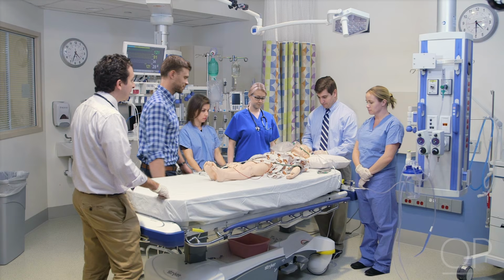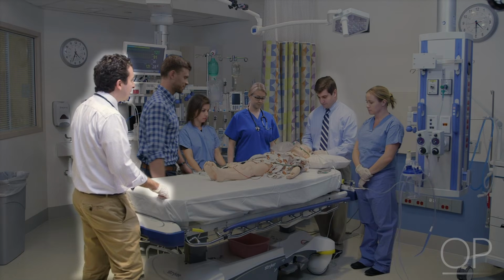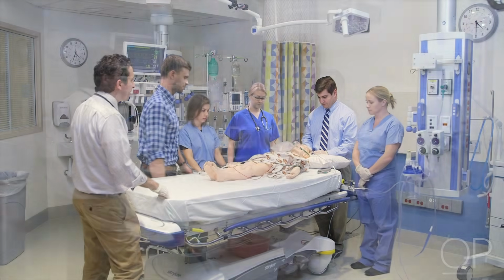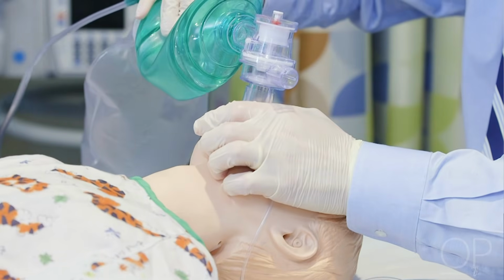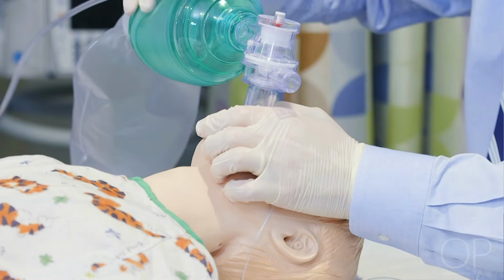Teams must be mindful of the duration of intubation attempts. The team leader should clearly communicate with the intubator to stop a given attempt and provide rescue ventilation, ideally before a patient shows signs of desaturation or clinical deterioration. Prolonged attempts should also be avoided in patients in whom progressive hypercarbia is of concern, for example, when there's a concern for increased intracranial pressure or severe metabolic acidosis.